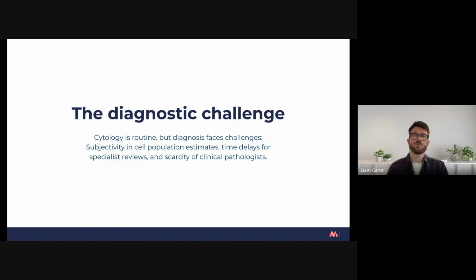But before we get started, I want to talk a little bit about the diagnostic challenge that we face in the veterinary world. And Dr. Davis did a very good job of setting this up, right? Cytology is routine in the clinic. You guys run a lot of cytology tests, create a lot of cytology slides, but the diagnosis of these and using these is difficult. There is subjectivity in the cell populations and those estimates there. We saw plenty of figures in the earlier part of this talk where it really highlighted how difficult it can be to identify different kinds of cells and subsequently different kinds of lymphoma as well.